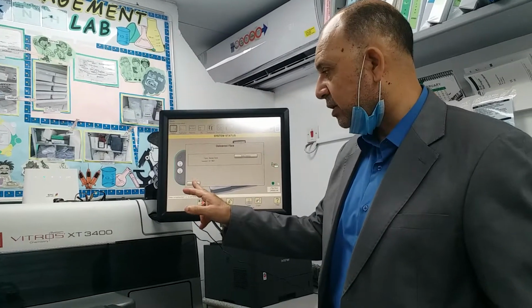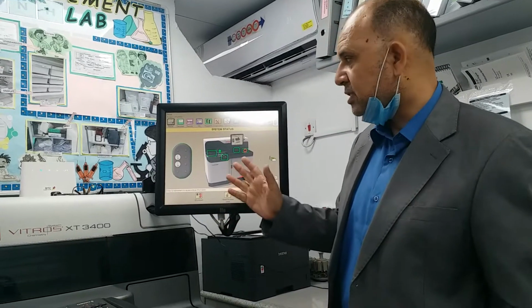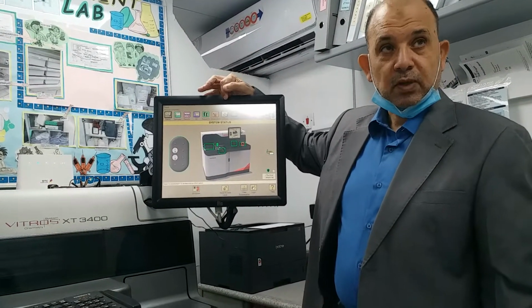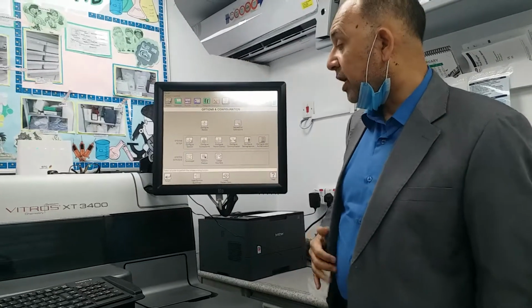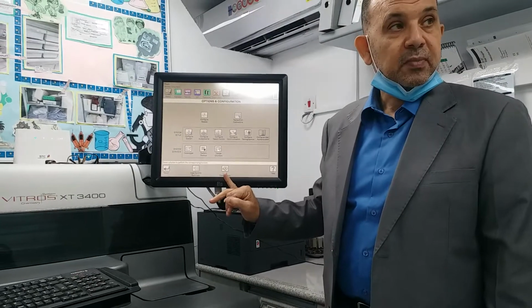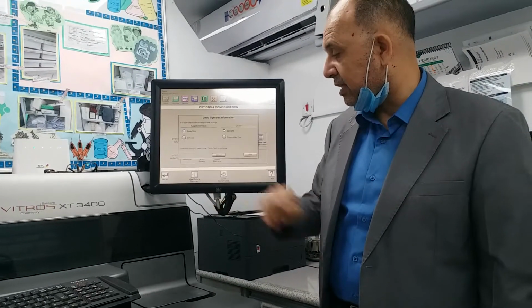I'll just say okay, thank you. Then I'll go to Option. In Option, I have here Load System Data. I'll click that one.